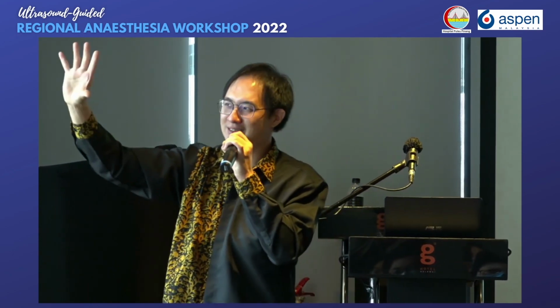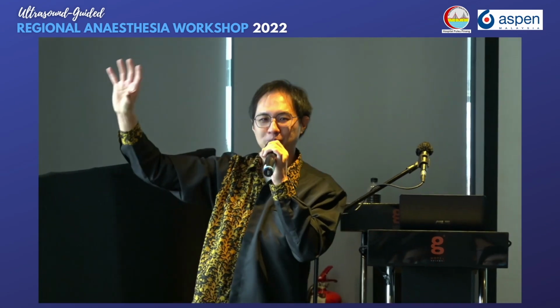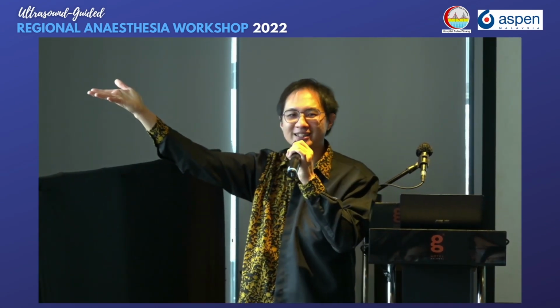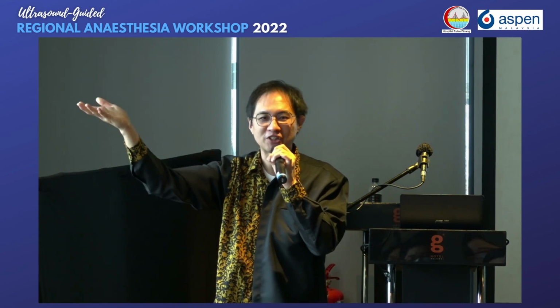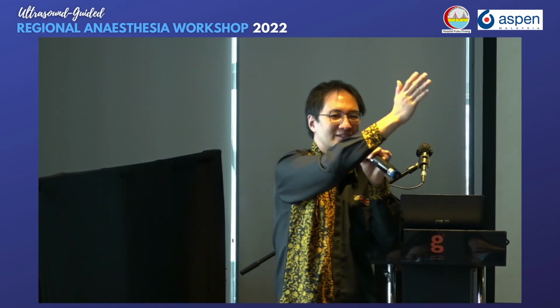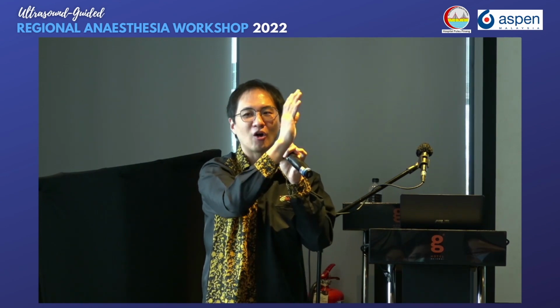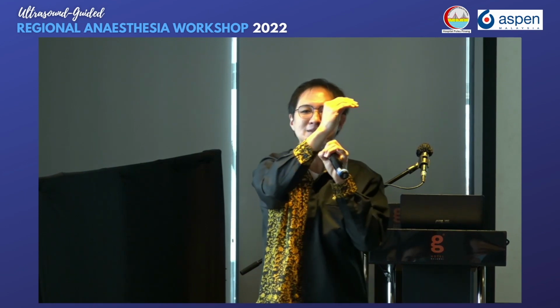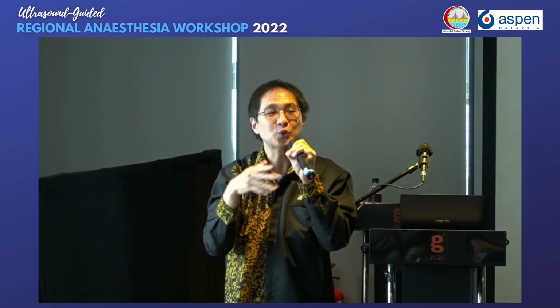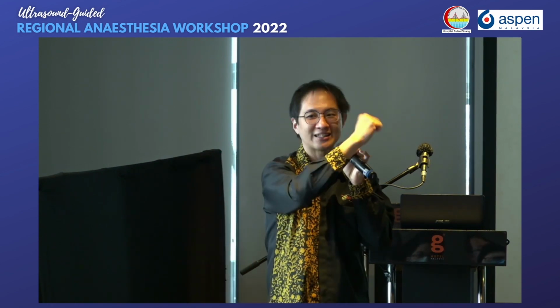But at the origin and insertion site, it's more superficial. The insertion site is the popliteal crease, so that is very superficial. The other place where you can catch it, where it's superficial, is at the origin of the biceps femoris muscle before it enters the gluteus maximus. We can show you during the practical session later how to trace the sciatic nerve.